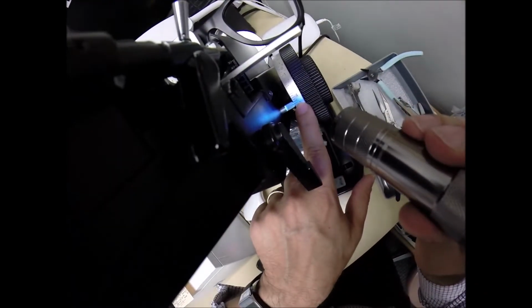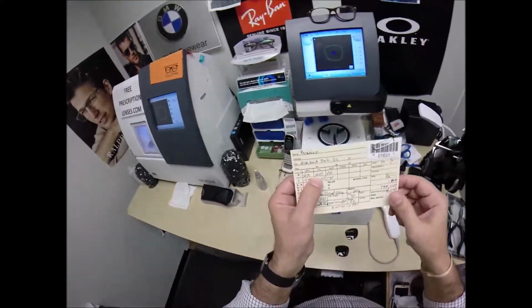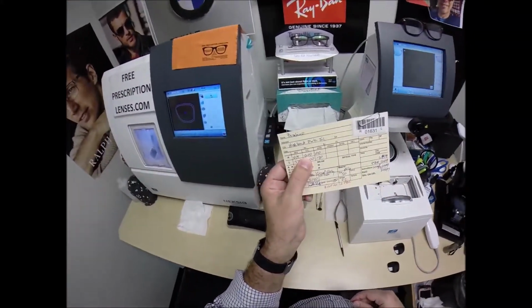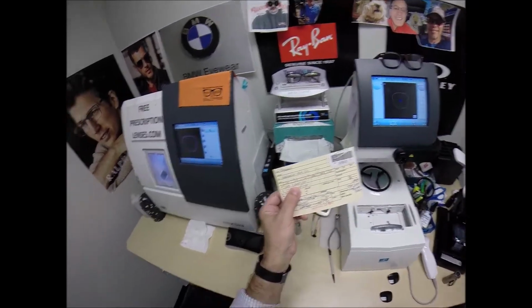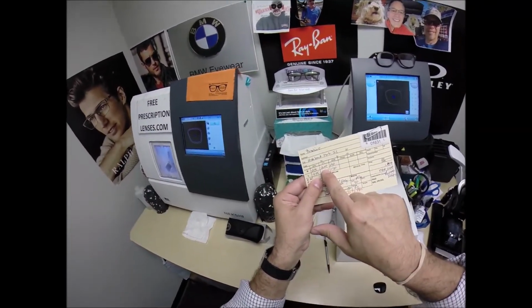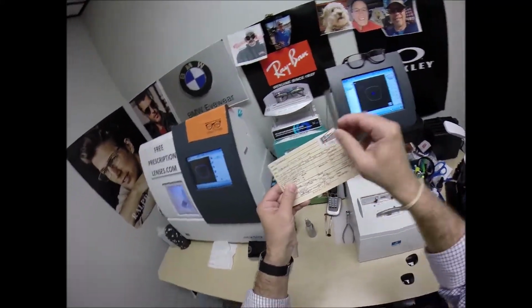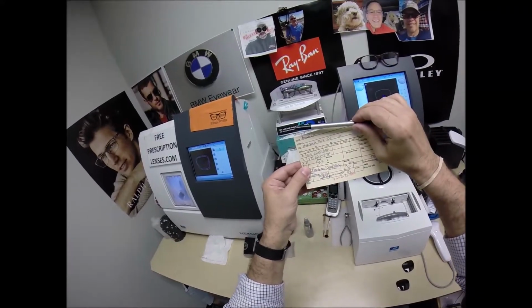Look at that, 475, one tick mark away from 5. Now, uncorrected astigmatism makes 6s and 8s look alike, as well as the letters P and F. So that's the fine tune knob. We're going to turn that fine tune knob from 0 to 90 to 180. We don't have to go that far. We're only going to go to 10.